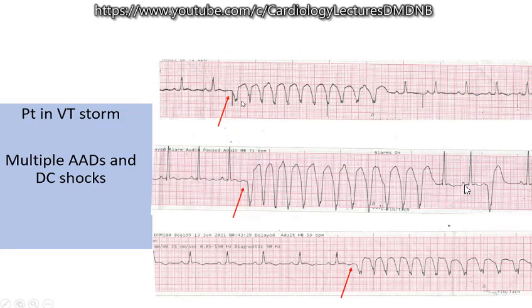One is this VT is of a sudden onset. That is, the onset of VT is not preceded by a VPC or a short cycle. And the second feature is that the first beat of the ventricular tachycardia is similar in morphology to the subsequent beats. So these two features, that is the sudden onset of the ventricular tachycardia as well as the first beat resembling the rest of the VT, point towards that this monomorphic VT could be likely due to a scar-related re-entry mechanism. Again, there are some exceptions to the rule, but it more often suggests that it is a scar-related re-entry.